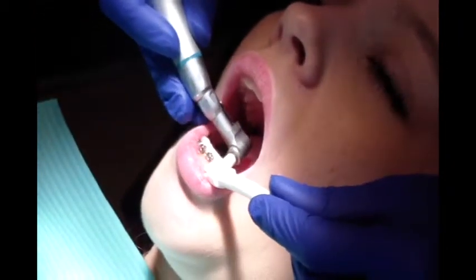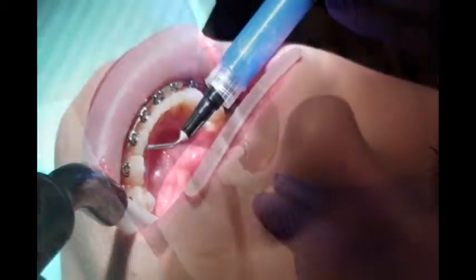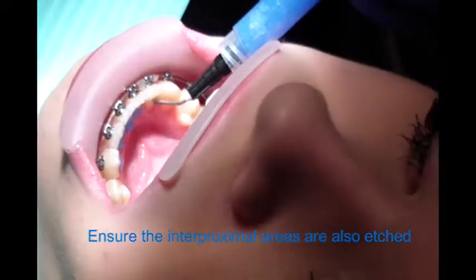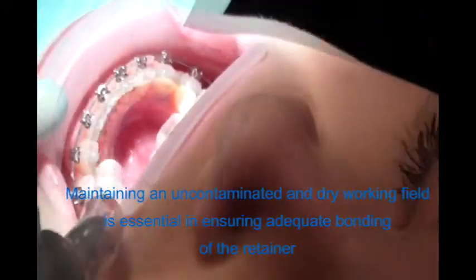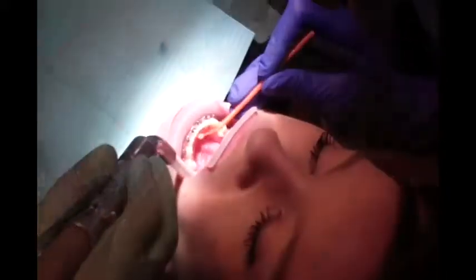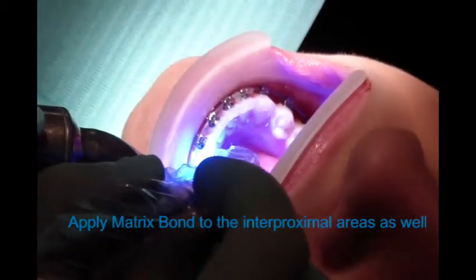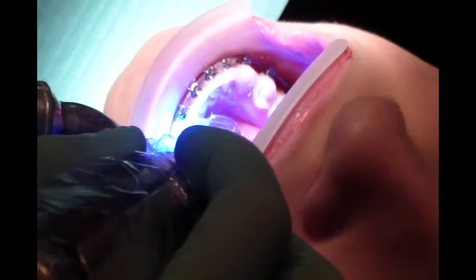Pumice the two surfaces onto which the retainer will be bonded. Apply phosphoric acid to the lingual two surfaces, let sit for 30 seconds, and rinse thoroughly. Gently air dry the two surfaces and apply a coat of matrix bond to them. Light cure for 30 seconds and maintain a dry, uncontaminated working field.